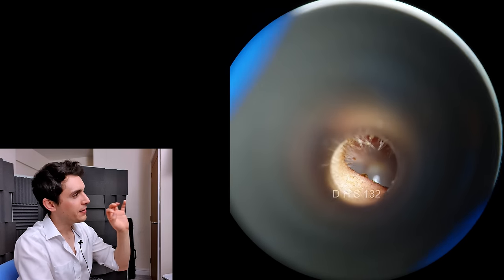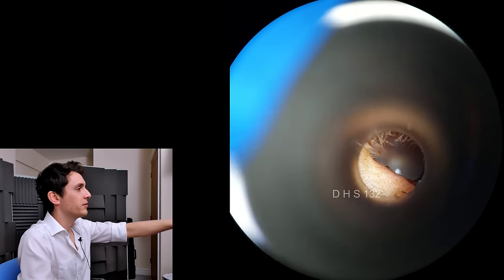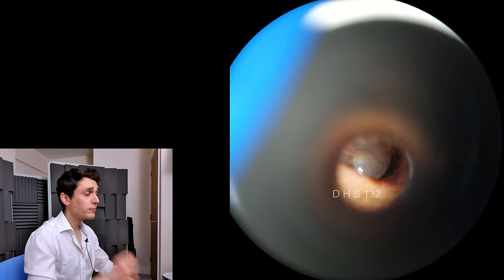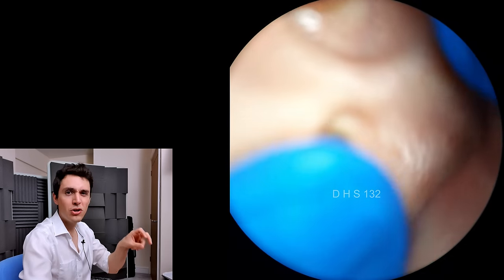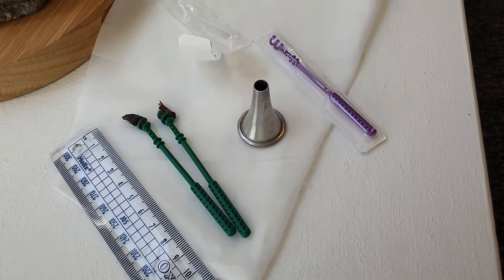I'm going in with a six mil metal speculum, and you can clearly see the smearing and smattering of wax around the canal. The patient was very comfortable during the procedure. Sometimes when you're advancing the device deep, they can feel a little bit of pressure or a twinge — in which case you stop advancing the device, give it a turn, and then extract it.